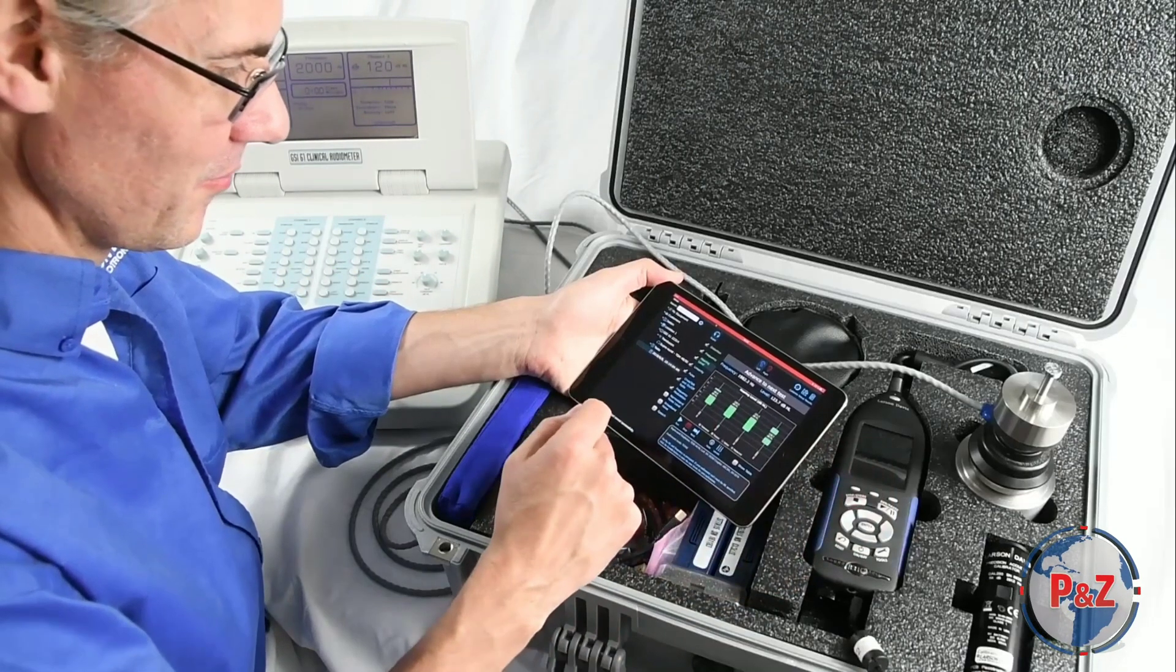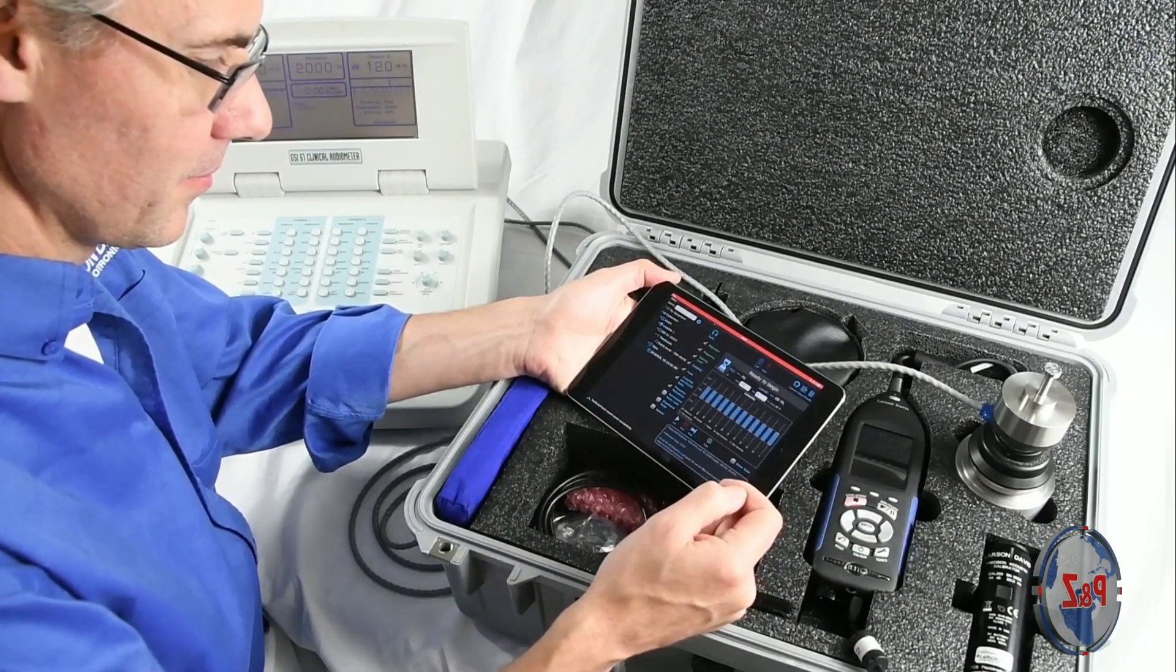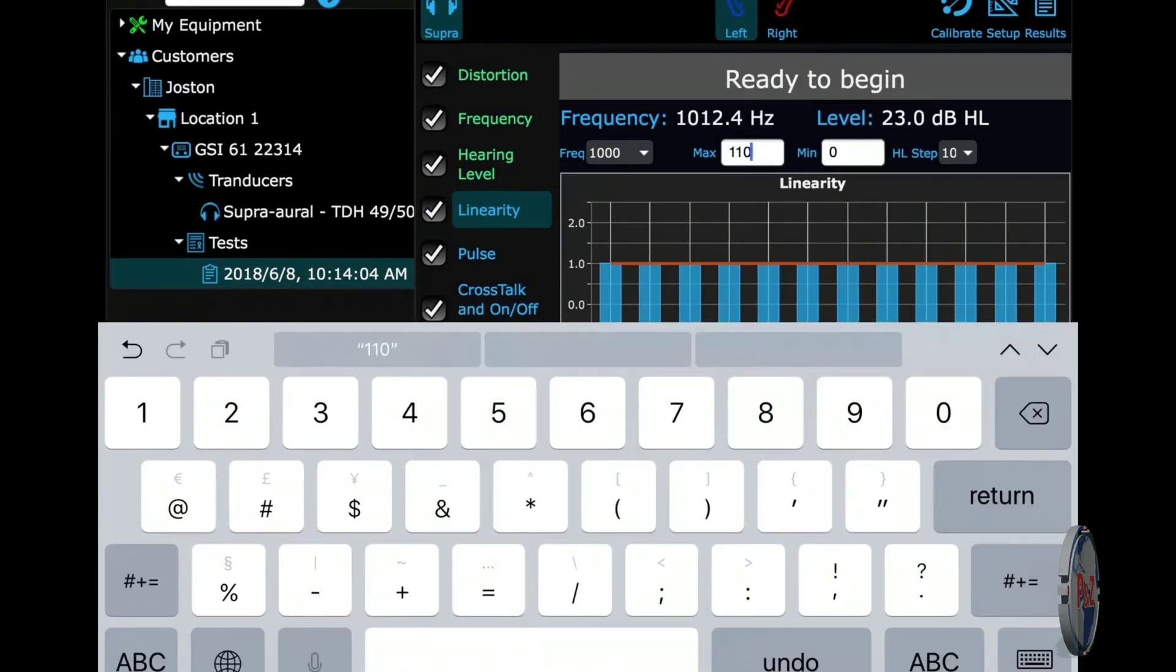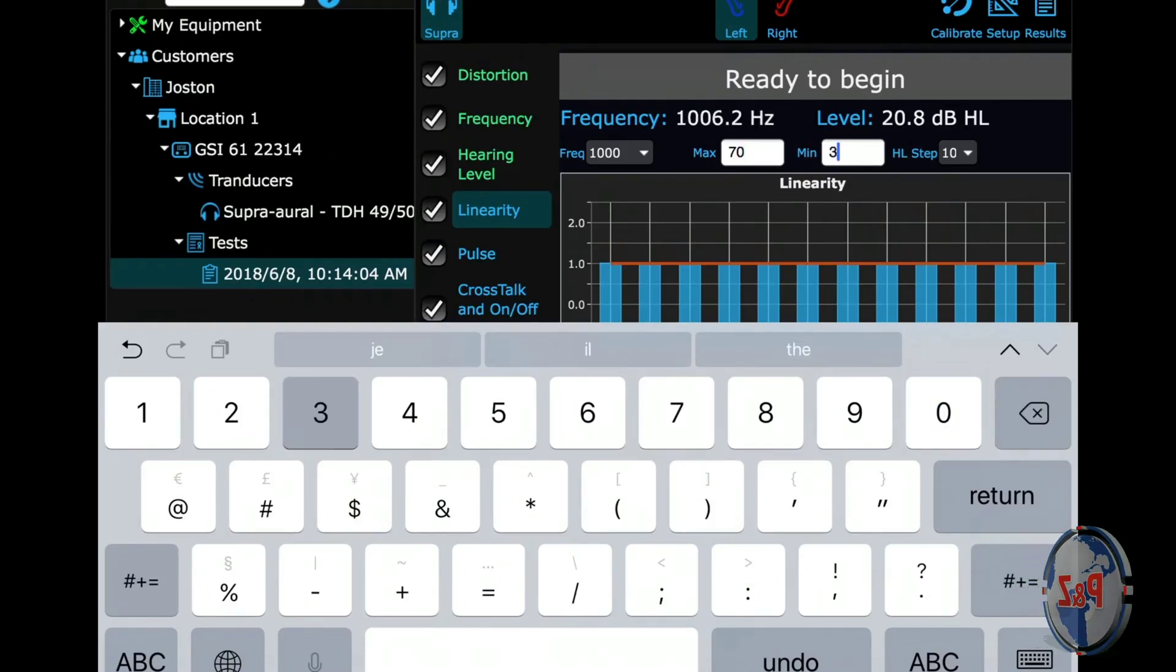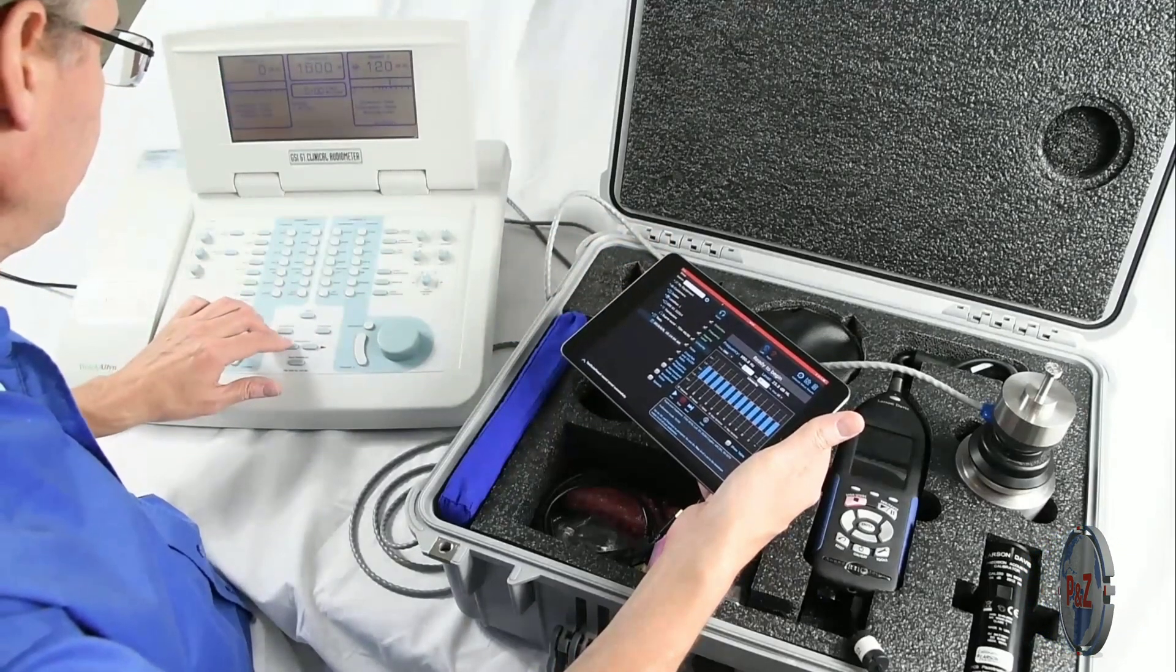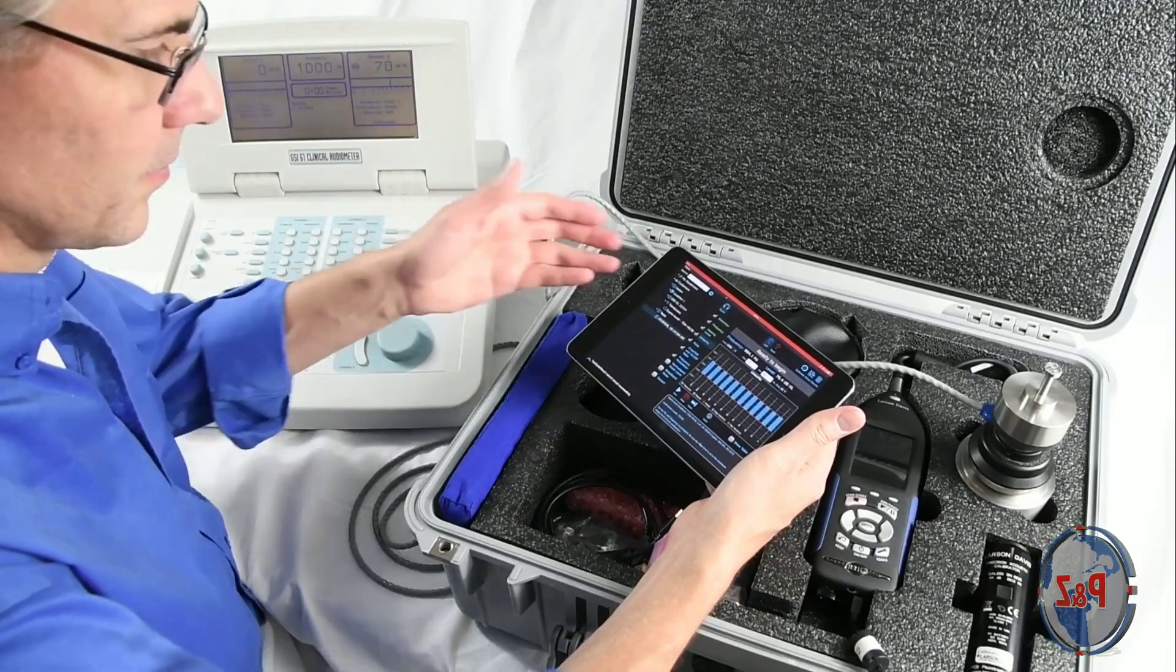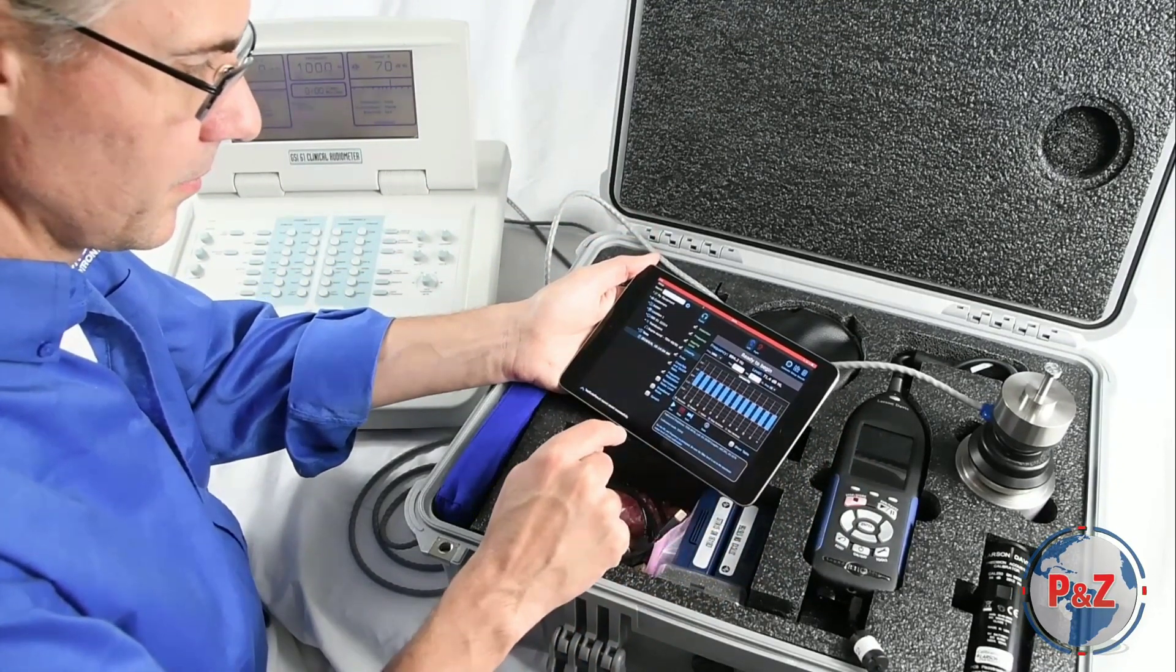To advance to the next test, you can select the next icon or choose the next test in the list. For linearity, select the frequency you want to test at. Brent chose 1 kHz. Then you enter the max and min level along with the step size. This isn't necessarily the constraints of the audiometer, but rather where you want to test at. It is good to set up the test before you begin. Brent sets the audiometer to 1 kHz frequency and the max level to what he indicated. Then he selects run.